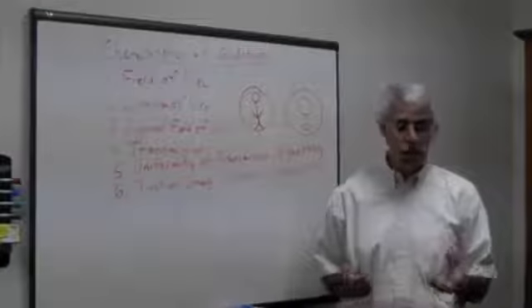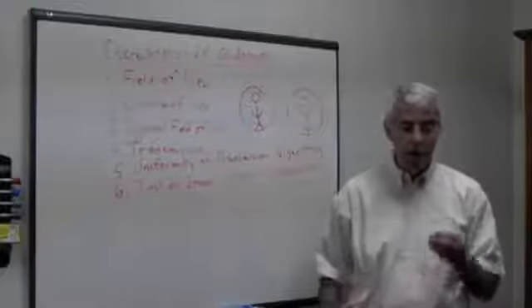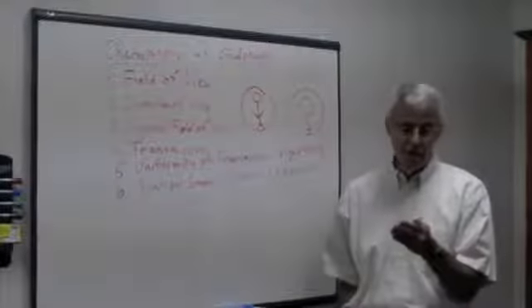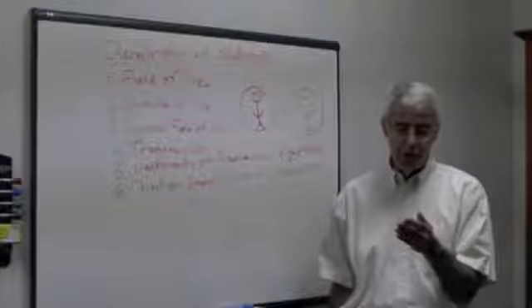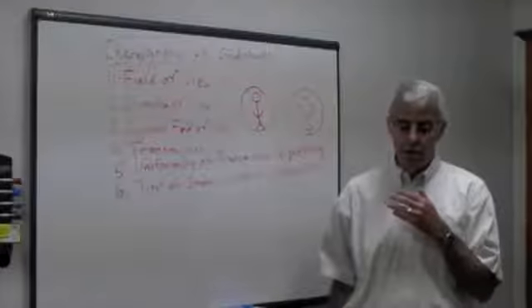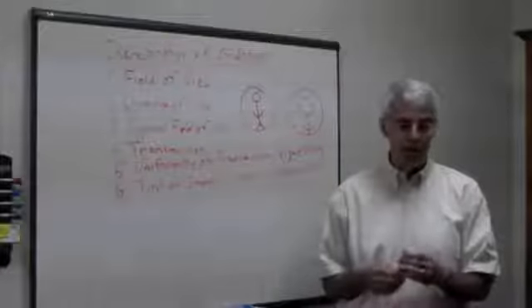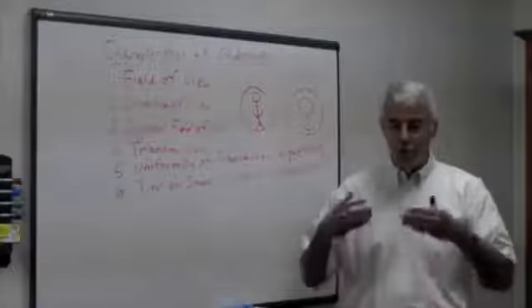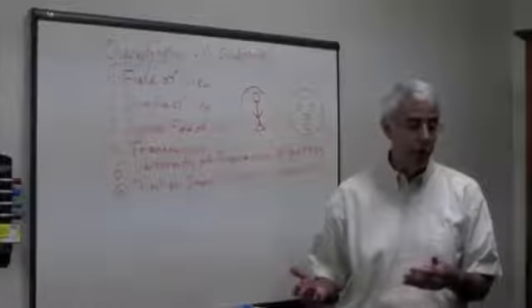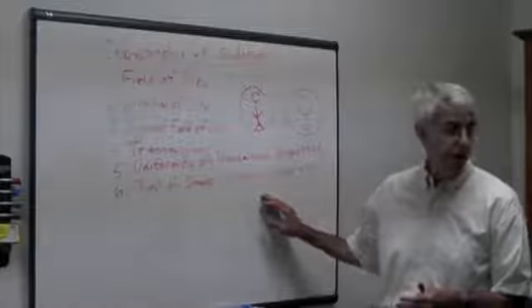The anti-reflection coatings on the individual lens components in an endoscope, when you have 30 air-to-glass interfaces and you're off in your anti-reflection coatings by a very small amount, it can drastically adjust the tint of the image. If the repair organization puts in new lenses and they don't have the proper anti-reflection coatings, you can have the effect of having a yellowish image.